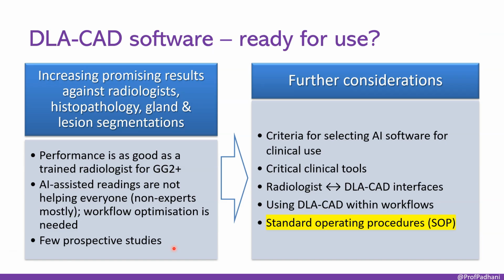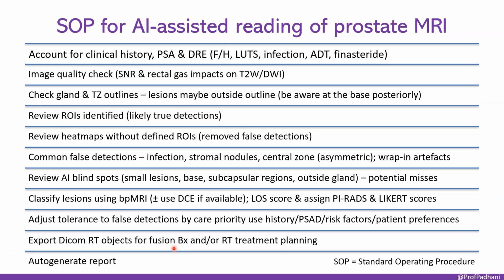Implementation. Slide 35 hammered home the absolute necessity of standard operating procedures, SOPs, when you bring AI into the workflow. Why are these so vital? SOPs are just fundamental, absolutely critical for ensuring both safety and consistency when you start using AI. It doesn't matter which workflow you choose. Safety and consistency. Yes. You need clear, well-defined guidelines so that everyone on the team, all the radiologists, maybe the techs, the urologists involved, uses the AI tool in the same way, understands its role, and crucially, understands its limitations. Professor Patani was very clear.